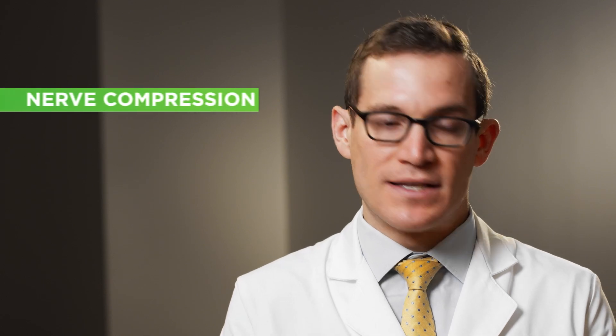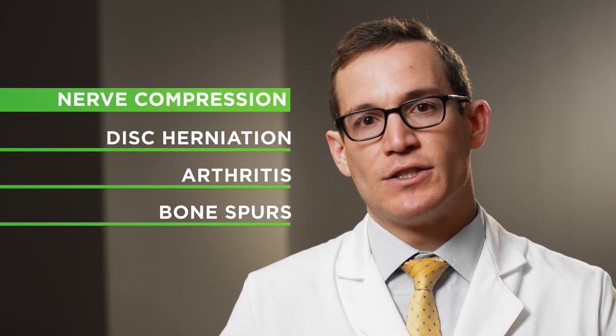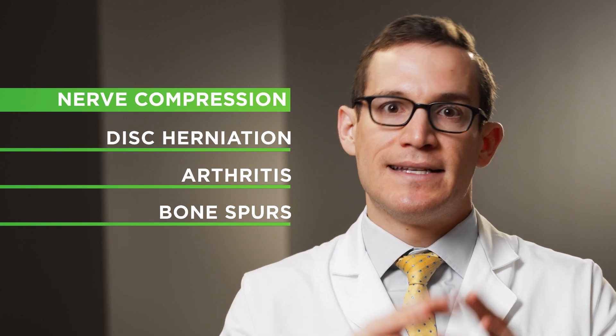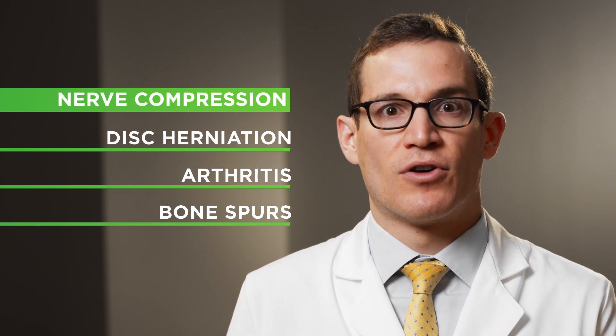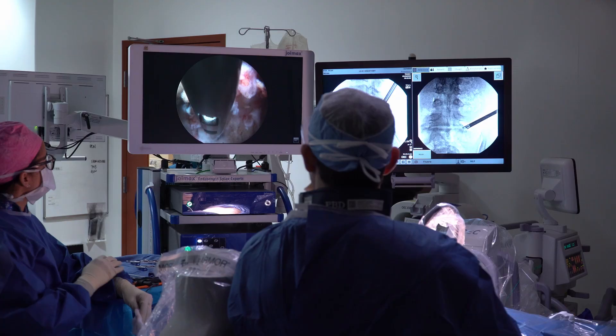Endoscopic spine surgery is applicable to a wide variety of problems. It's mostly people who have compression of their nerves — whether that's from a disc herniation or arthritis and bone spurs. It's really a tool that can be used to decompress or take pressure off of nerves, and the way that manifests is usually with sciatica or pain running down the legs.